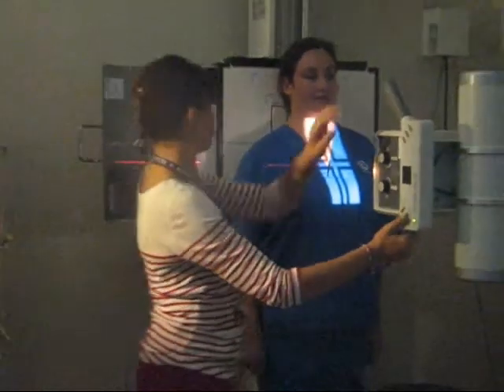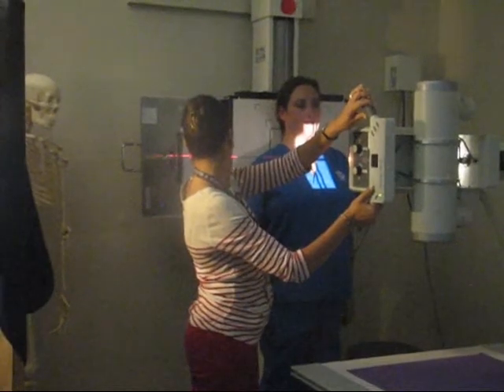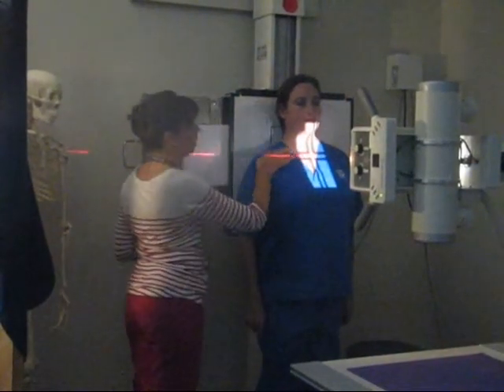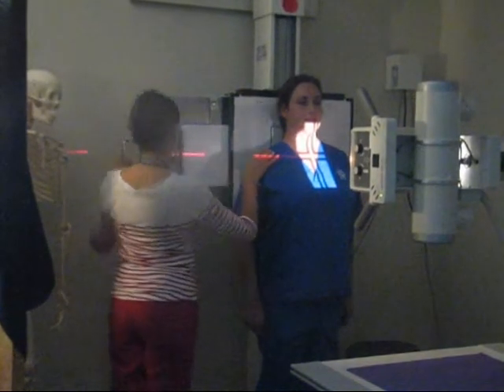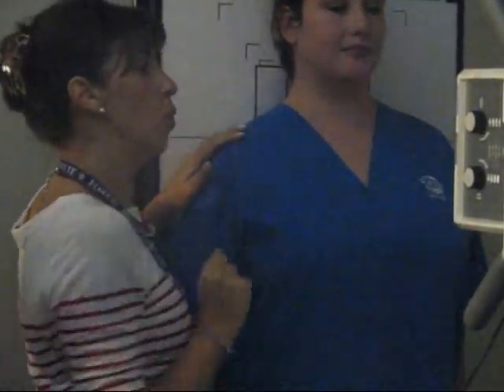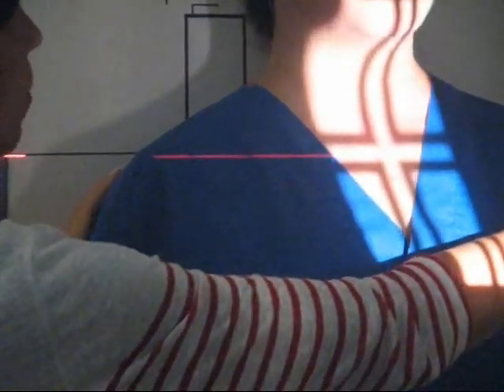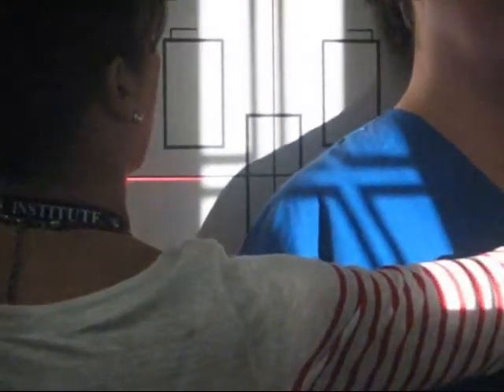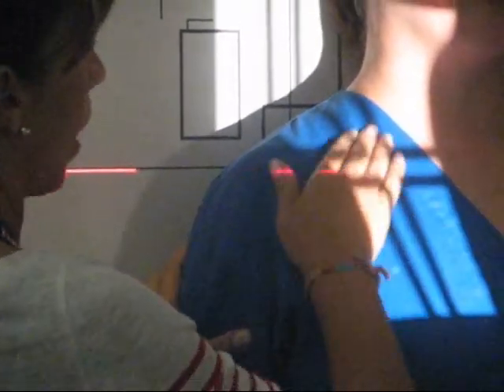Okay, so we're going to center your central ray. As you can tell, it's pretty much aligned with her clavicle already. Okay, so your central ray is going to want its midpoint in the middle of the clavicle. Okay, so we're going to have our patient step that way. Very good. That was maybe a little too much. Just go this way a little. Right there. Okay.